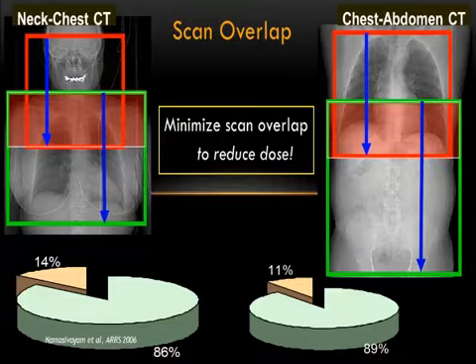Lymphoma is another place where we would do a single run chest and abdomen CT. We are not looking for lesions in the liver. We are looking for lymph nodes, which can be seen in a single run, right?